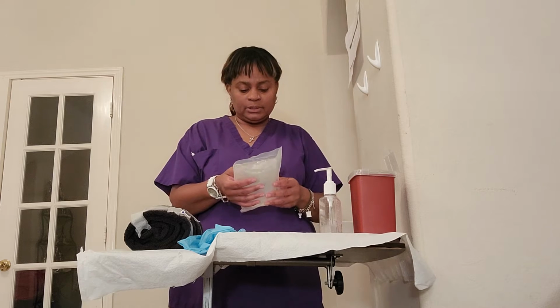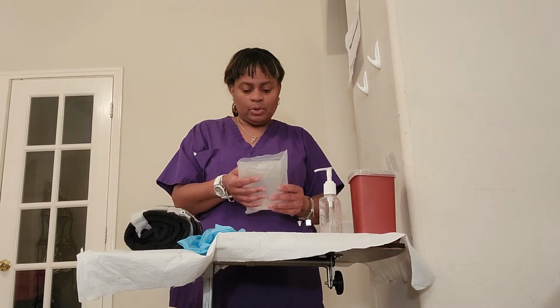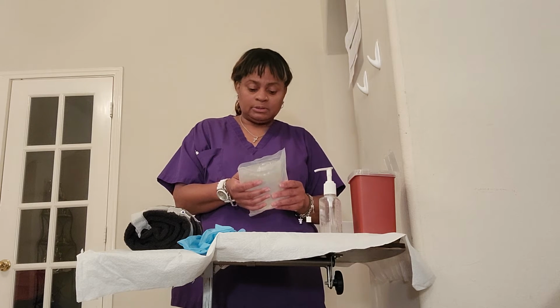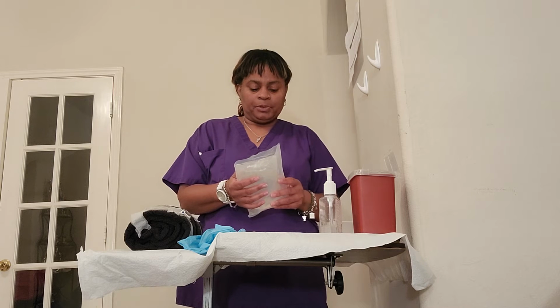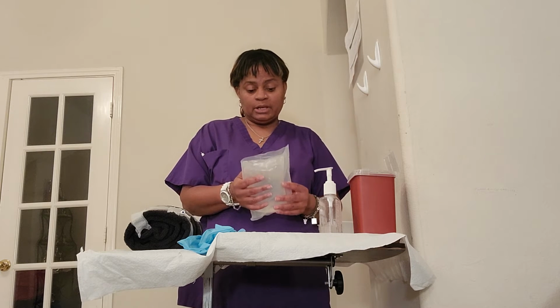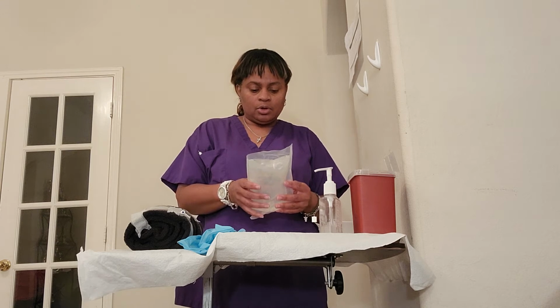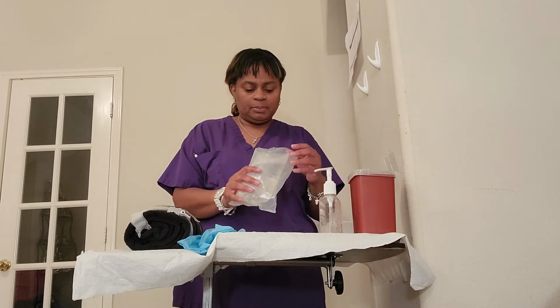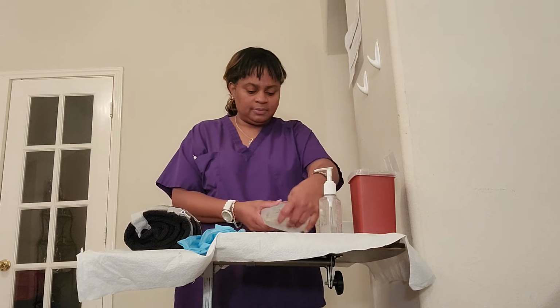And once again, everything looks good on the package. It's 500 ml. 100 mLs contains 900 milligrams of sodium chloride. Expiration date again, September 2022. I am now going to go ahead and remove this from the package, and I verified her medication 3 times.